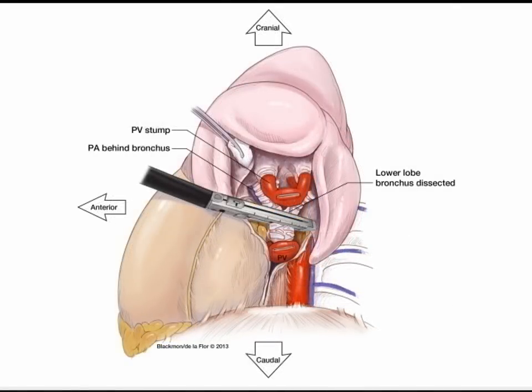Once you've divided the inferior branch of the pulmonary vein going to the left lower lobe, encircle, staple, and divide the bronchial branches going to the left lower lobe. Those branches are easily encircled, stapled, and divided. However, you must take caution when passing the stapler around this bronchus as the pulmonary artery lies just on the other side. If you are concerned about this dissection and want to ensure you are not getting into the pulmonary artery, you can also take a fissure approach.